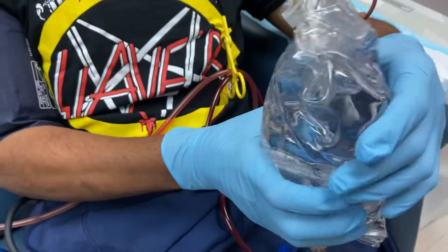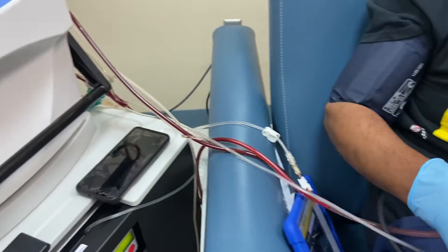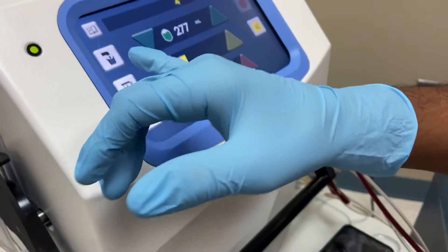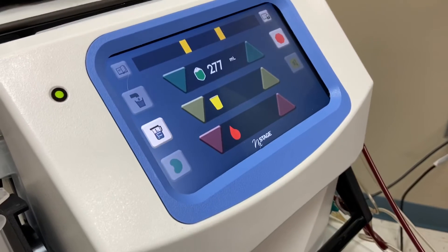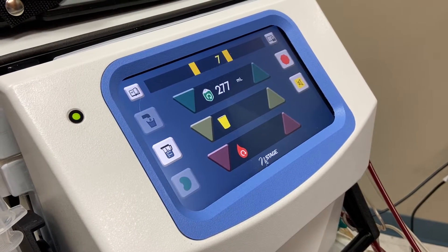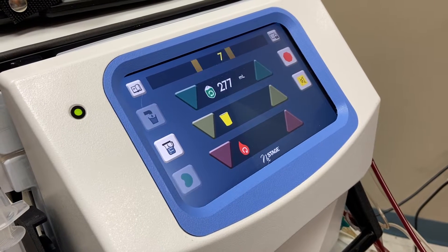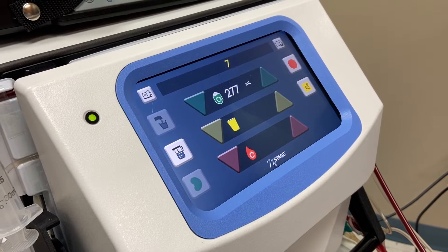Now release the squeezing and hit the add fluid. Now the machine will start rinsing the venous.